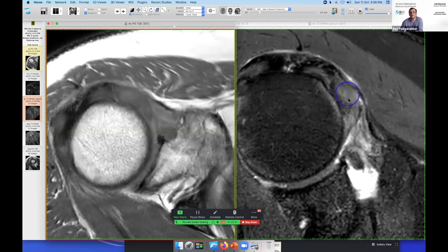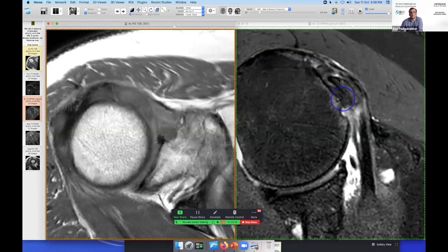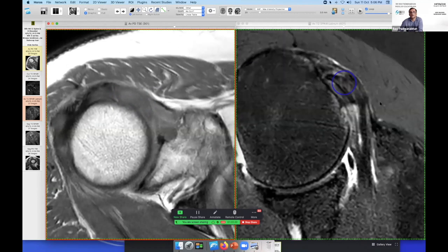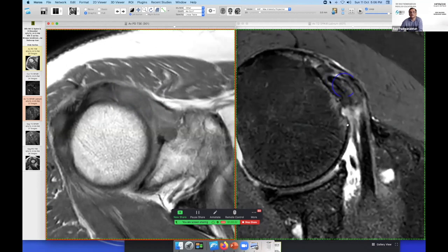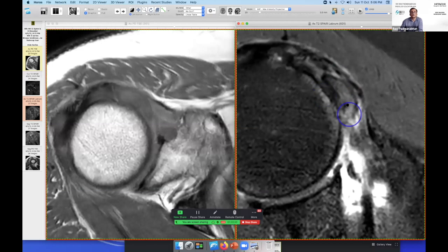The tendon is ill-defined and it's thick — it's really big. As we scroll through, it starts to approach more normal size, but it's still big and still hyperintense. The key thing is that it's hyperintense, but not the hyperintensity of fluid — this is tendinosis. You would say there is severe tendinosis of the biceps tendon at the portion just proximal to the intra-articular portion.